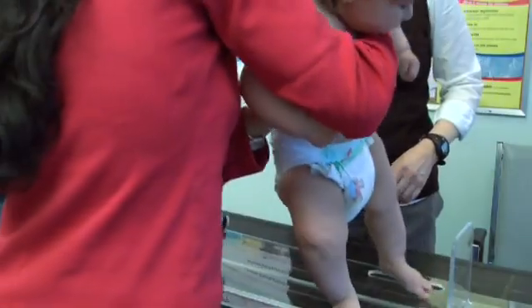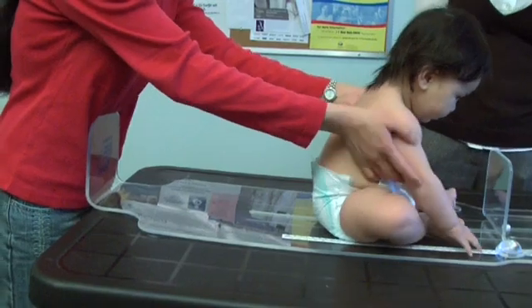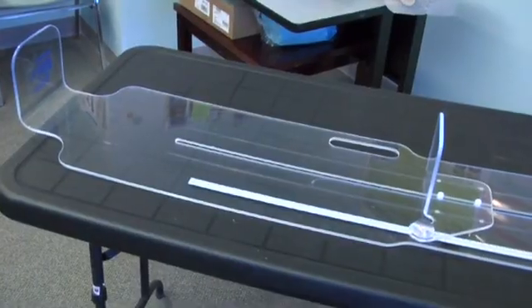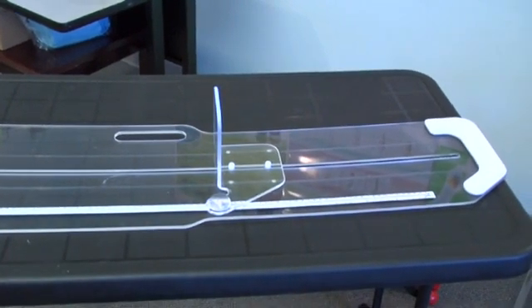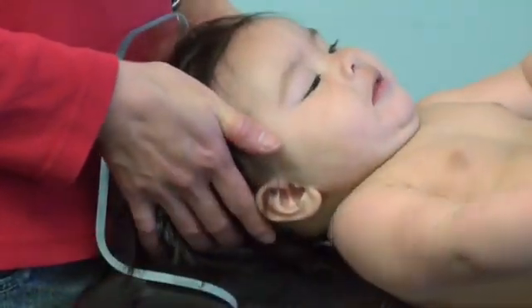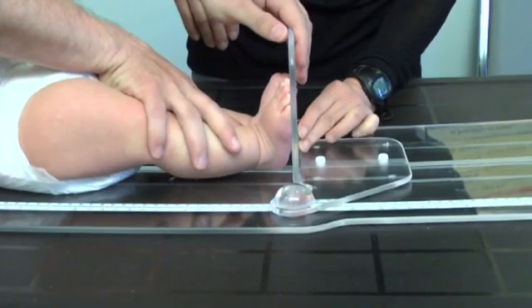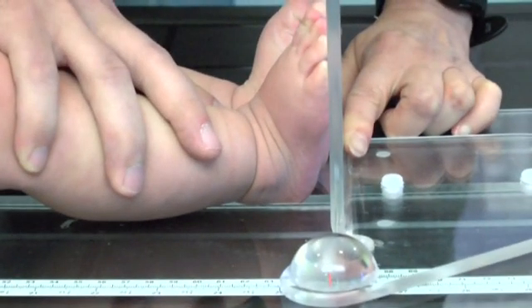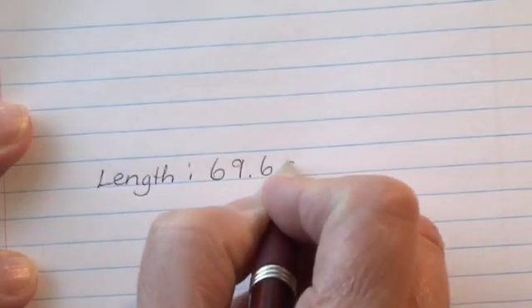Measuring an infant's length requires two people: one trained health professional and a parent or guardian. Measure the infant without shoes and wearing light underclothing or a diaper. Use a calibrated length board or infant measuring mat with a fixed headpiece and a movable footpiece perpendicular to the surface of the table. The infant should be placed on its back with the parent or guardian holding the infant's head against the fixed headboard, with the infant looking up. The health professional should straighten the infant's legs, bringing the feet into contact with the footboard and holding the feet in place while taking a reading. Record the length to the nearest 0.1cm.